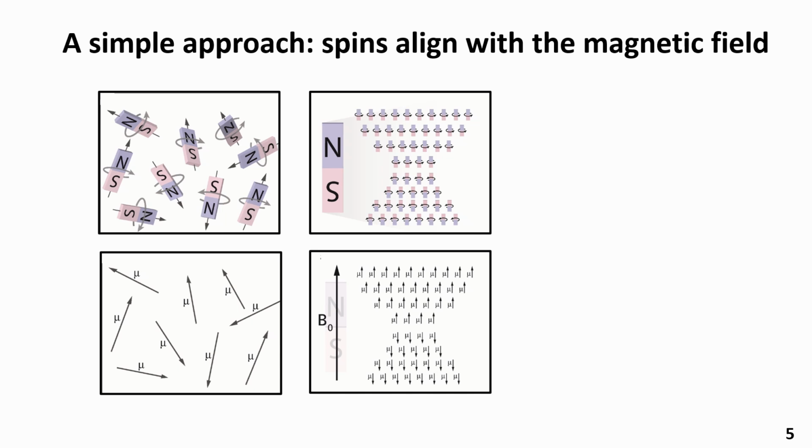Because of this static magnetic field, you see that the spins, the tissue magnets, align parallel or anti-parallel with this field, pointing up or down. There's about 6 in a million more pointing up than down. Most of the spins cancel out each other.